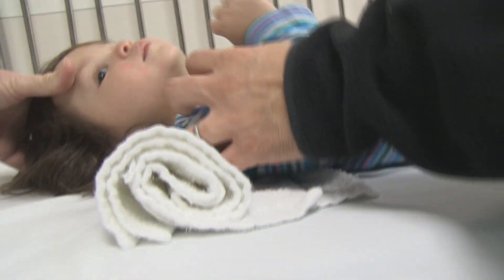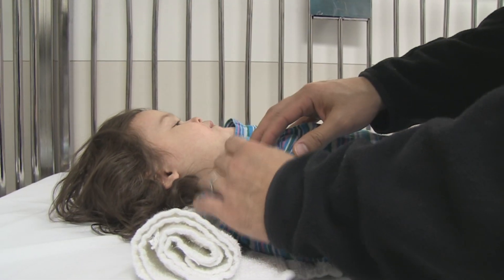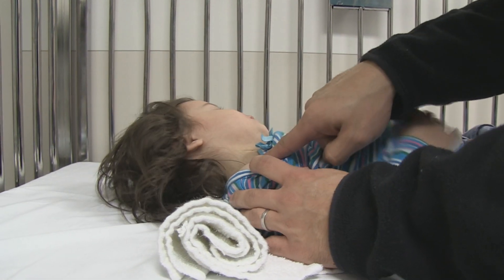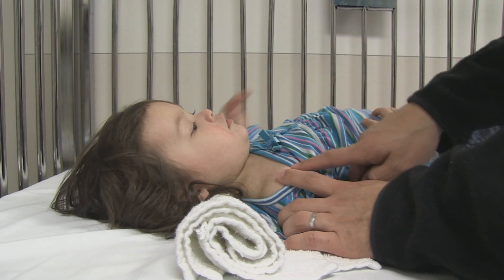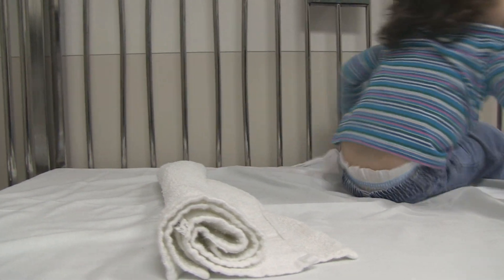The ideal intubating situation is to have the tragus of the ear line up with the anterior surface of the shoulder. I've always used the apex of the shoulder, but clearly that is a better alignment.